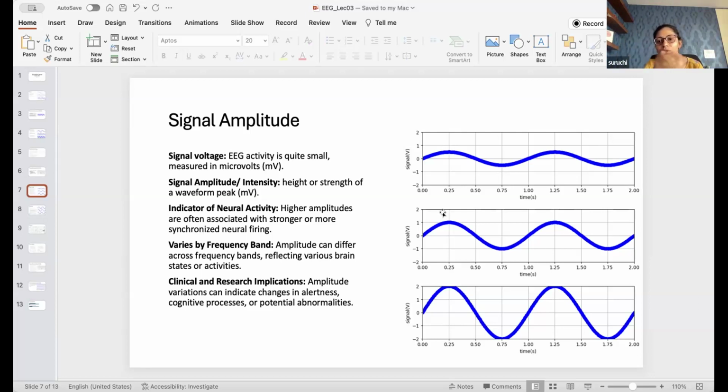That's why I was saying, if you understand these three concepts, phase, amplitude, and frequency, you basically understood EEG. That's all there is. The only requirement is to understand how these change as your brain behavior changes. That is the research part, but fundamentally, a wave is characterized by frequency, amplitude, and phase. We'll come to phase. Signal amplitude is related to power. So when we talk about any brain state, we'll talk about its frequency, frequency range or band, and its power or amplitude.